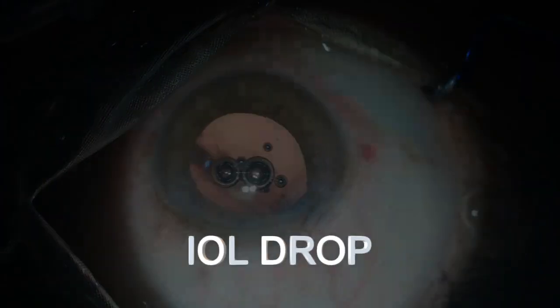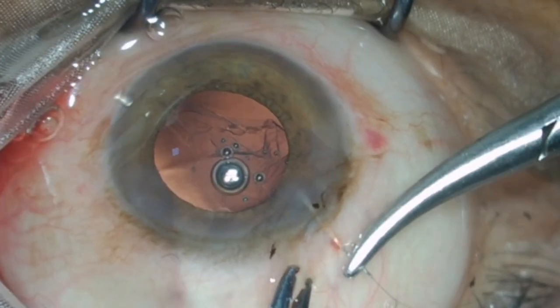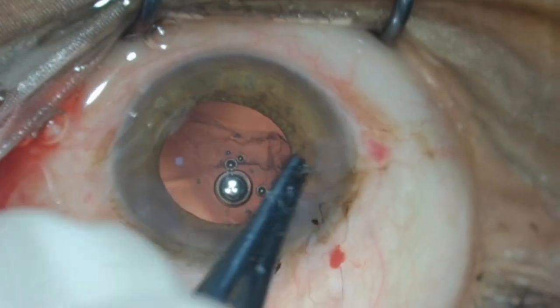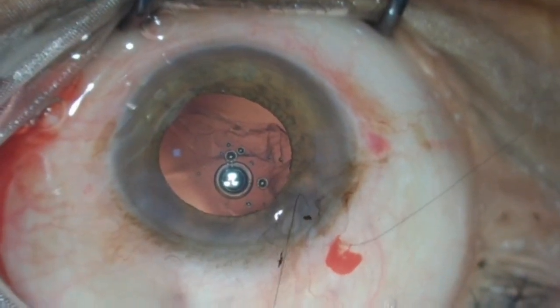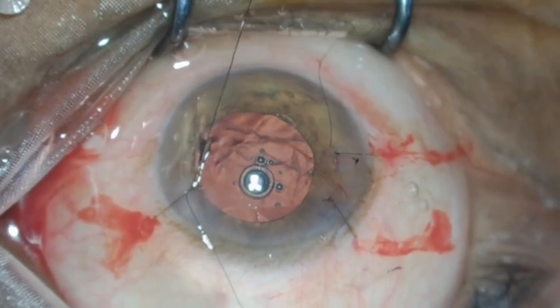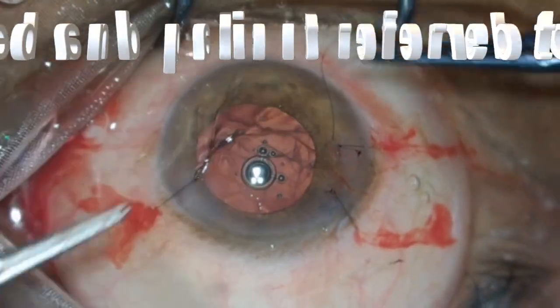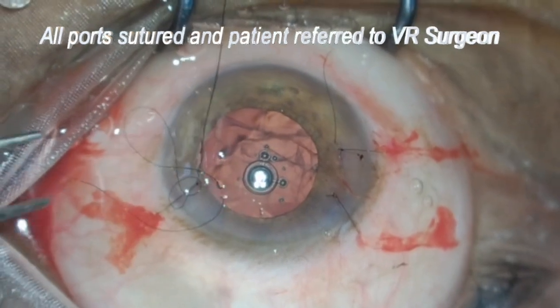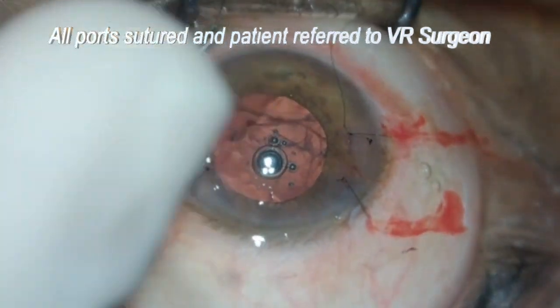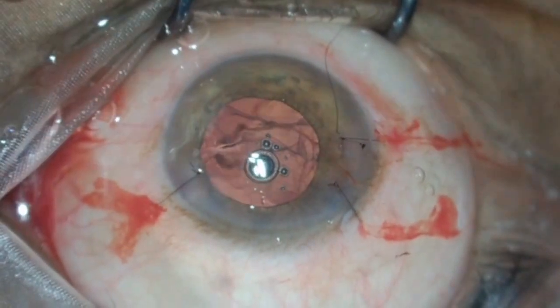It was observed that the IOL was slowly sinking into the vitreous like a Titanic sinking into the bottom of the ocean, which is a cataract surgeon's nightmare, where you have to refer a patient to the VR surgeon. So we did the same with a heavy heart. All the ports were sutured and the patient was referred to the VR surgeon.